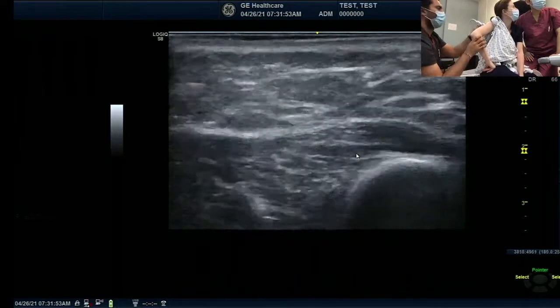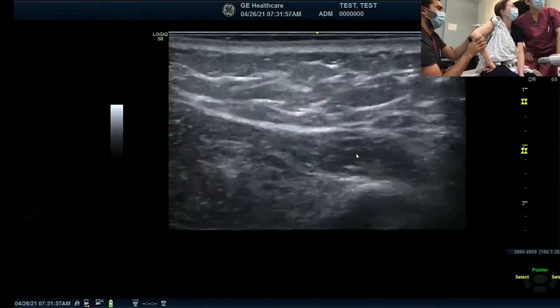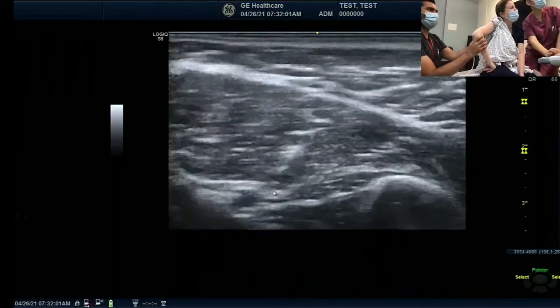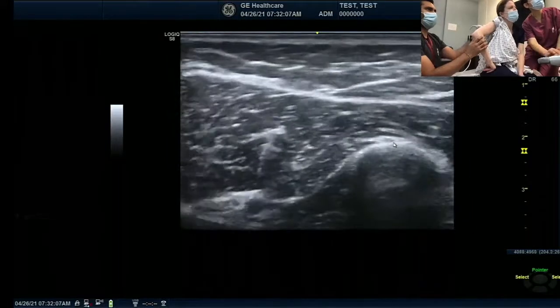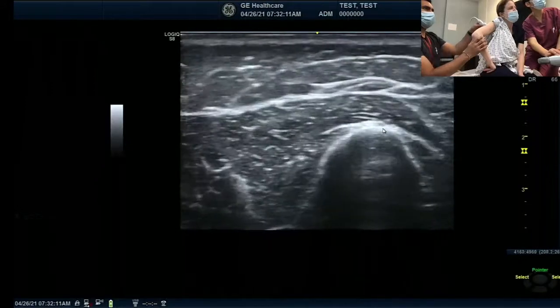Well, that's how it should be, theoretically. I know. But we found it here, radial nerve. Let's follow the radial nerve. Move here, moving already, going into the spiral groove. Okay, now continuously follow that one.